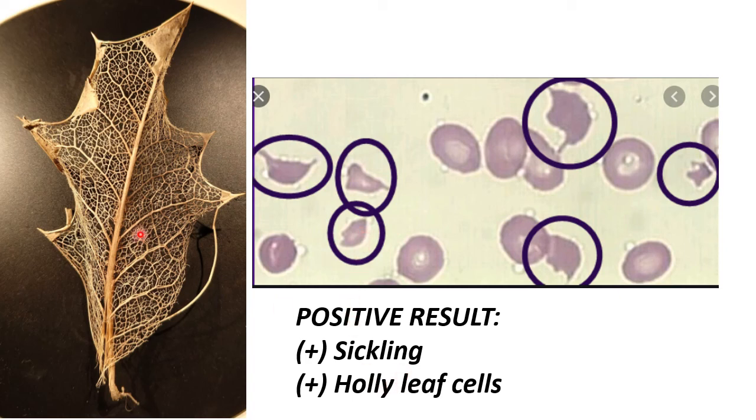Ano yung holly leaf ba? So, nakakita ko ng picture sa internet na medyo hindi siya perfect crescent shape. Okay? So, may mga edges yung mga yan due to sodium metabisulfite.